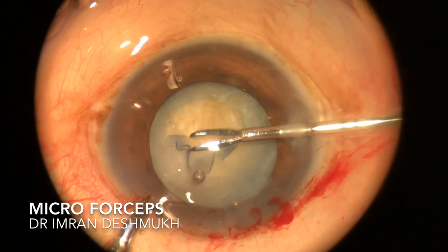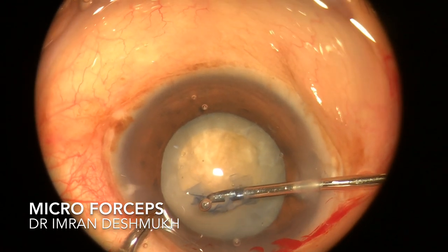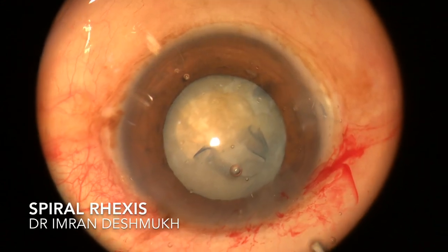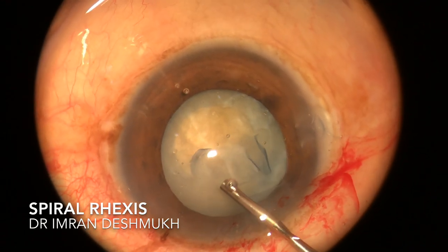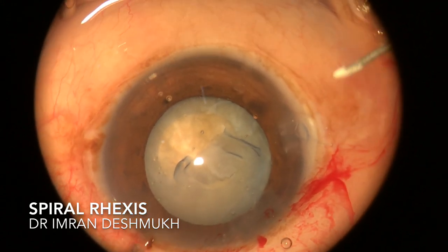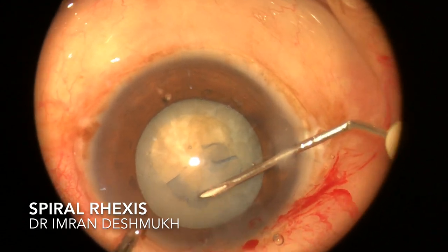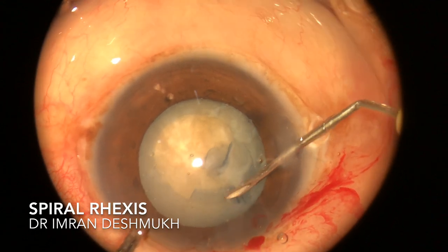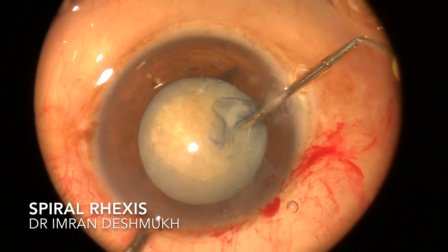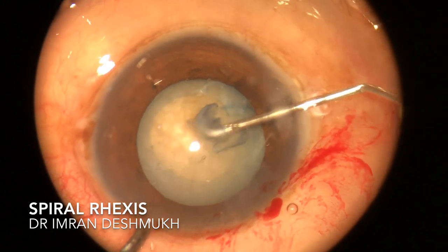My initial rhexis was a bit small so I had to do a spiral rhexis to increase the size. I used my micro forceps for that, and once I finished I put a little visco in the anterior chamber to keep it well formed. Then I brought in my cystitome — I'm a bit more comfortable with the cystitome for making a rhexis — and continued making the spiral rhexis with its help, achieving a five-millimeter rhexis size.